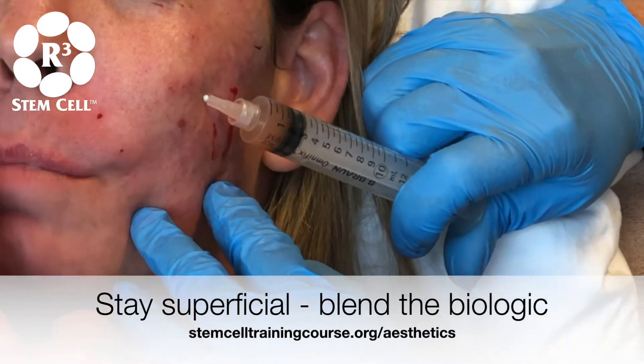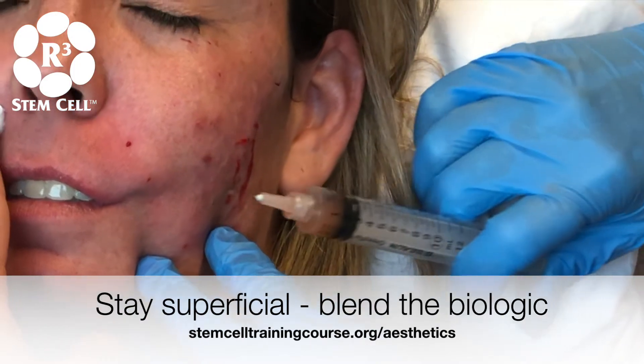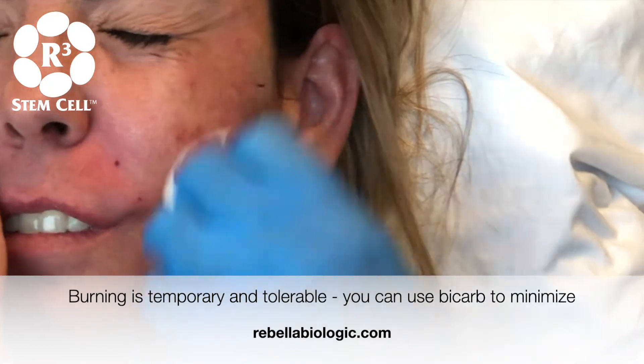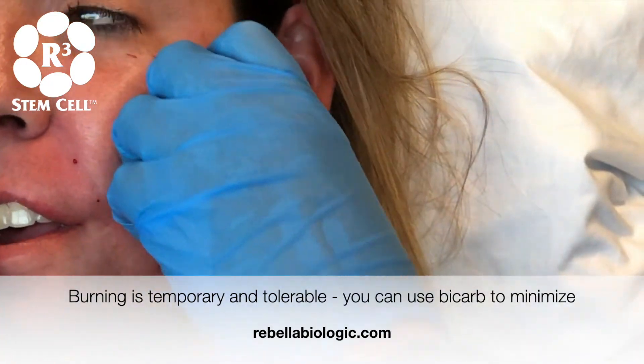You all right? It just burns. It does burn and sting, but let me tell you something — it's going to be less than 10 minutes, and that's going to be the best burn and sting you've had for your whole life.